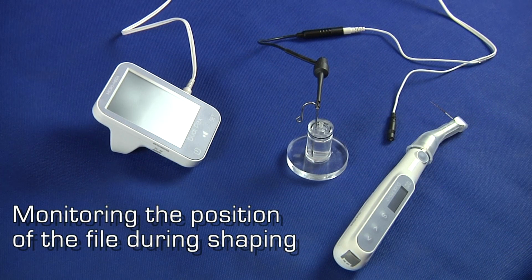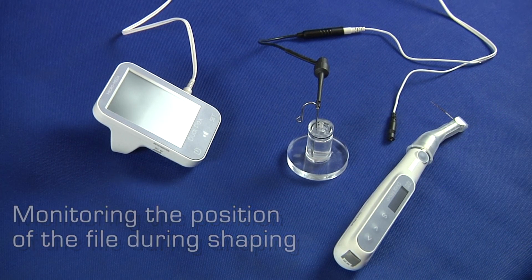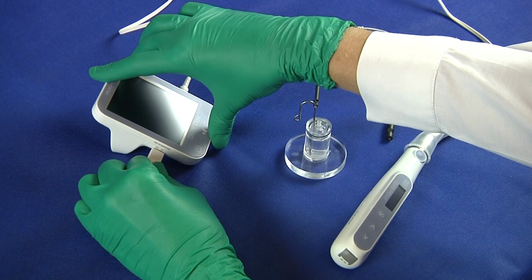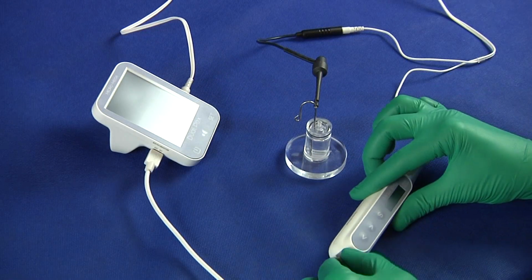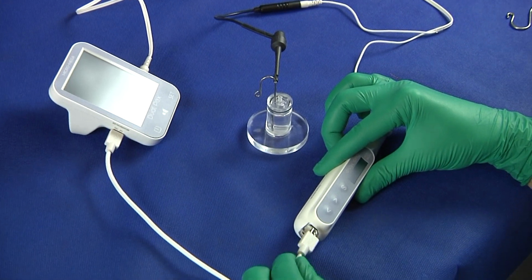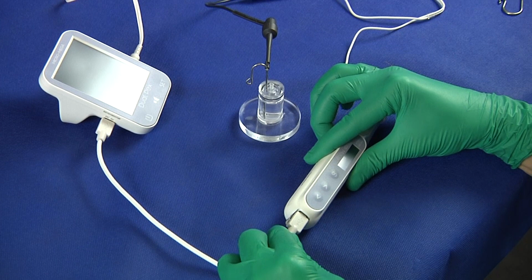Dual Move and Dual PEX make the perfect duo for successful root canal preparation. Combine them to monitor the progression of the file towards the apex during the root canal shaping. Plug the data transfer cable into the socket located on the left-hand side of Dual PEX and plug the opposite end to Dual Move.